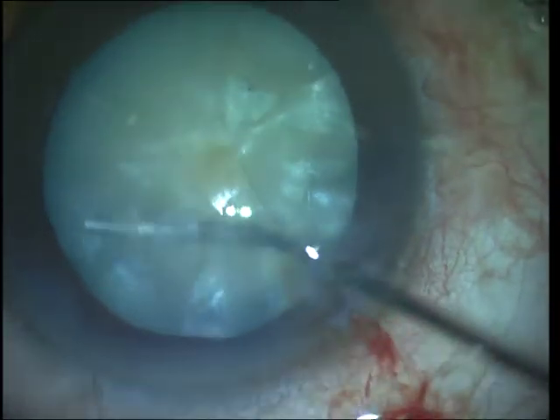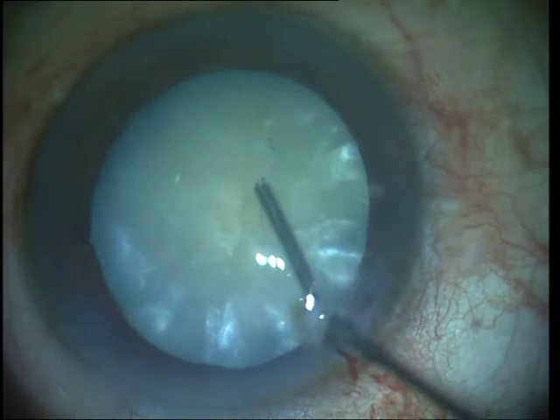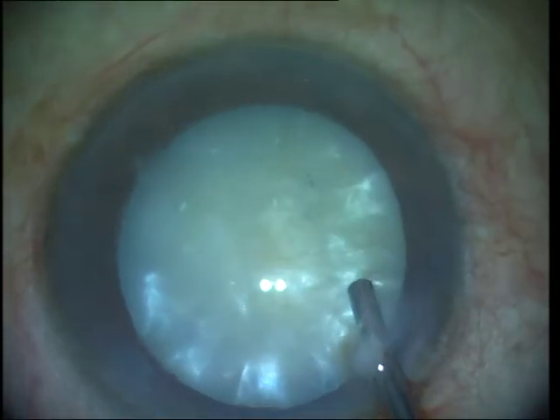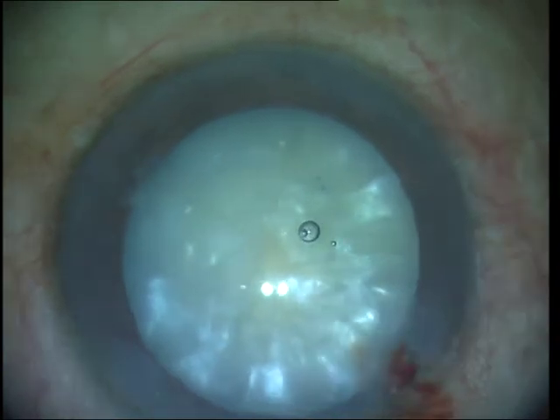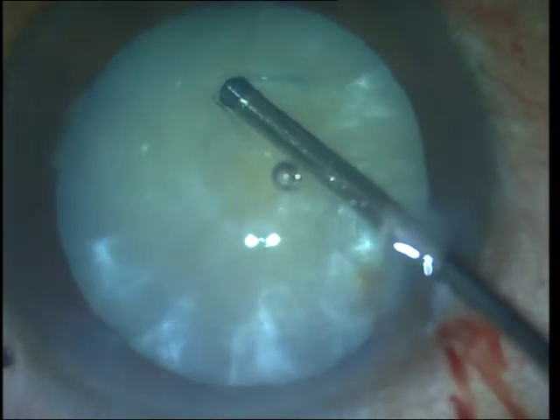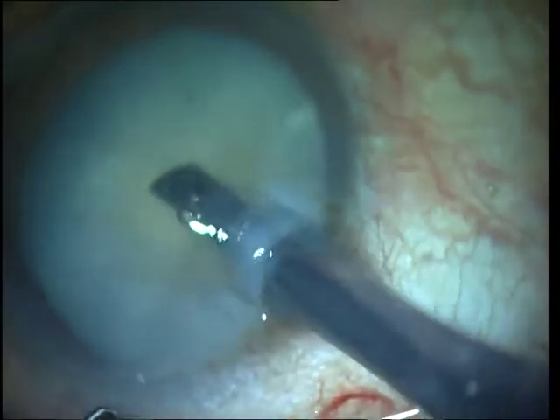I am doing very gentle multi-quadrant focal hydrodissection, taking care not to inject too much fluid which could cause a capsular blowout, as there isn't much space and the nucleus fills up almost the entire capsular bag. I also noticed that the capsulorhexis was actually incomplete, so I used forceps to complete it, and now it is time to do the vertical chop.